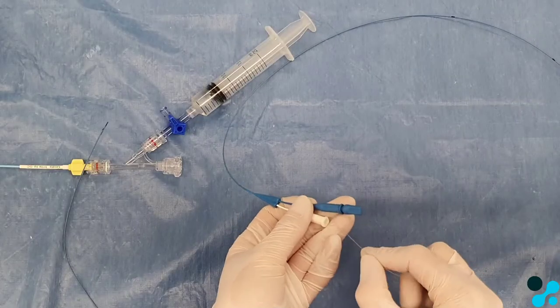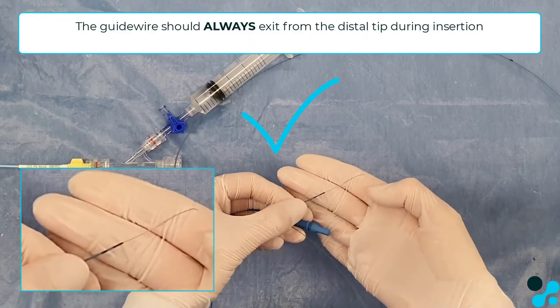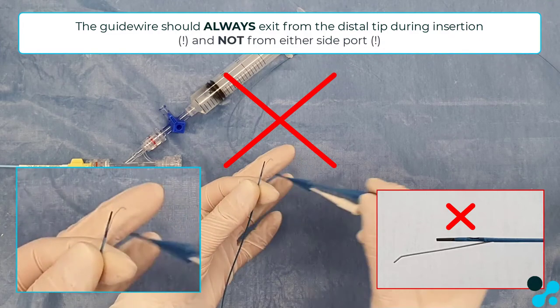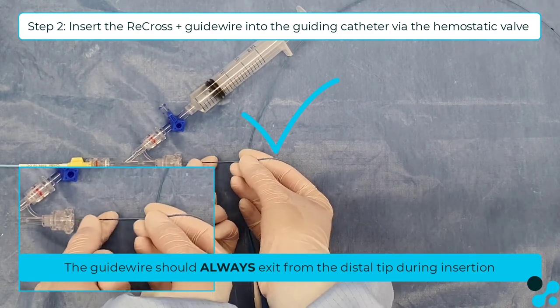The Recross can be inserted together with the guide wire. Backload the guide wire from the white tip hub. The guide wire should always exit the tip and not exit the proximal exit port — it should always come over the tip. Insert the Recross plus the guide wire through the hemostatic valve into the guiding catheter.